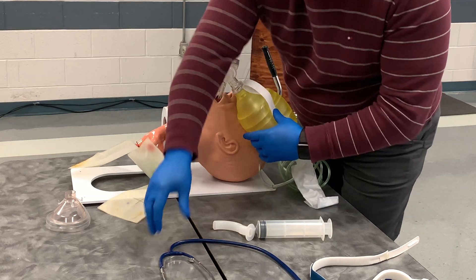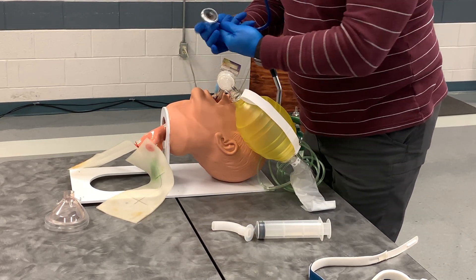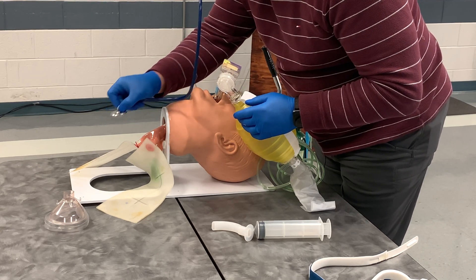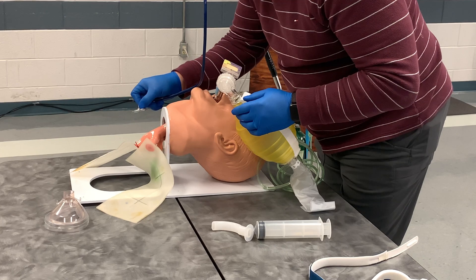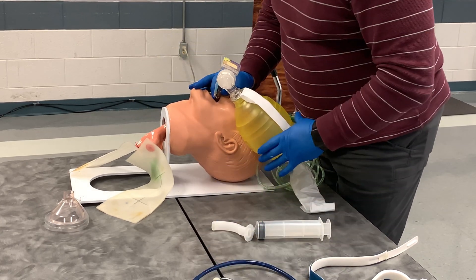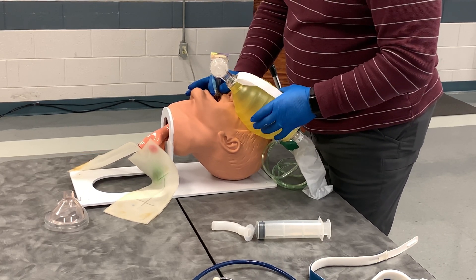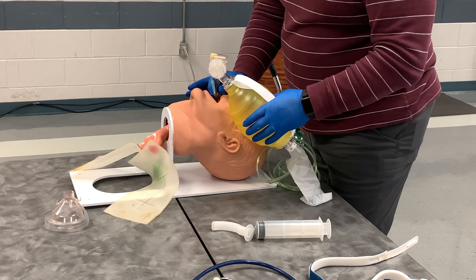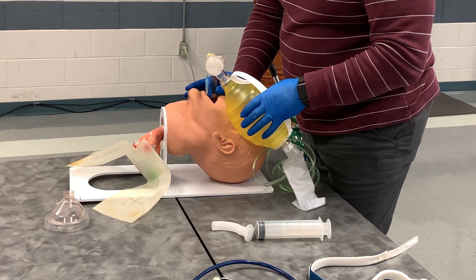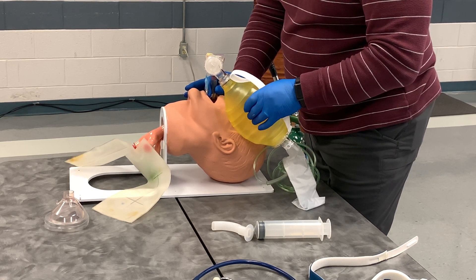I will let my partner continue to ventilate. I auscultate over the epigastrum to make sure there is no air entering the stomach, and then over each lung field to confirm placement. I am noting that my end tidal CO2 is turning yellow — remember, gold is good and purple is bad. So when it is turning yellow, that is a good sign; if it were purple or cyanotic, I would be in the wrong place.